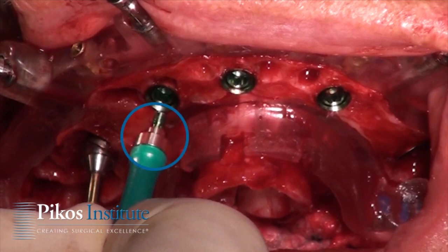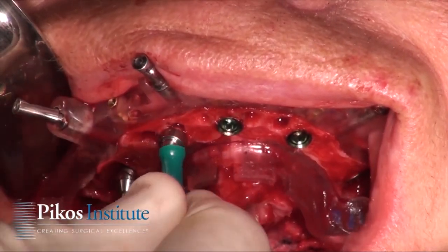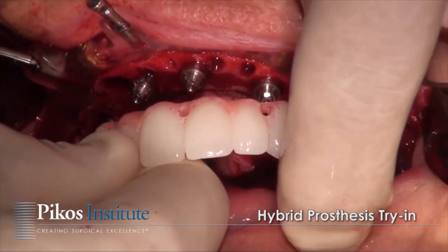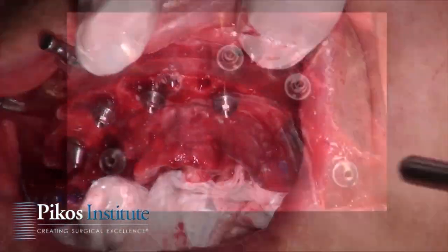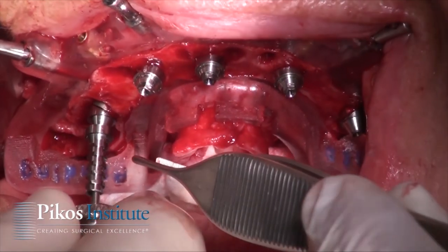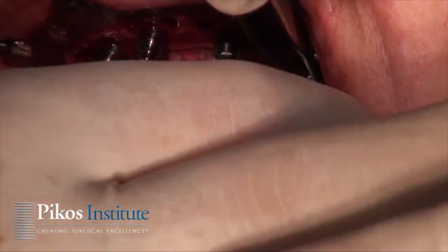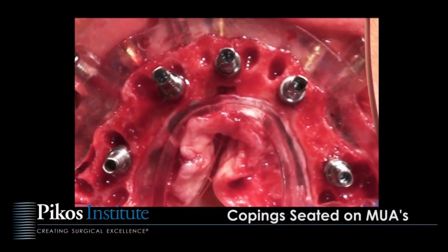And with each multi-unit abutment, we're placing this prefabricated prosthesis and just making sure we have good draw. Torquing down these particular multi-unit abutments to the appropriate Newton centimeter, in this case 30 for this BioHorizons system. And now we're basically using the copings that have been prefabricated, pre-selected and cut to size, so that saves more time intraoperatively. That's a huge advantage of this approach, is intraoperative time.